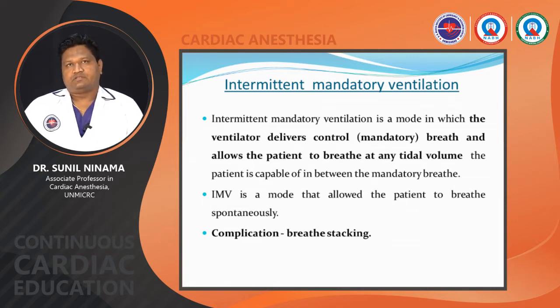When the patient tries to breathe in between, he can breathe in between, and on the ventilator, you have to set the tidal volume and rate. The tidal volume is given at the fixed respiratory rate and fixed tidal volume. So what are the complications? Breath stacking happens in intermittent mandatory ventilation.